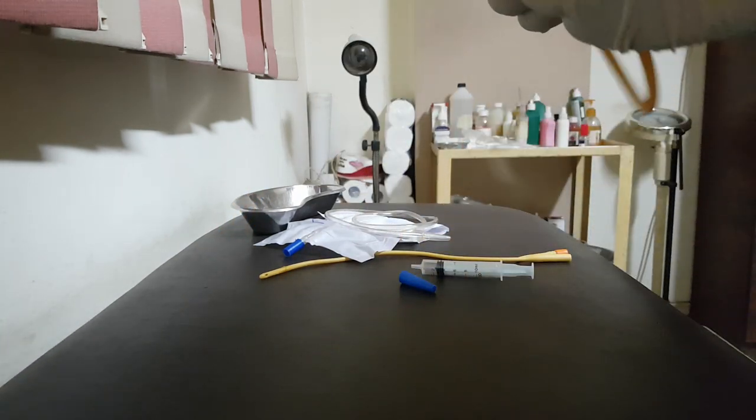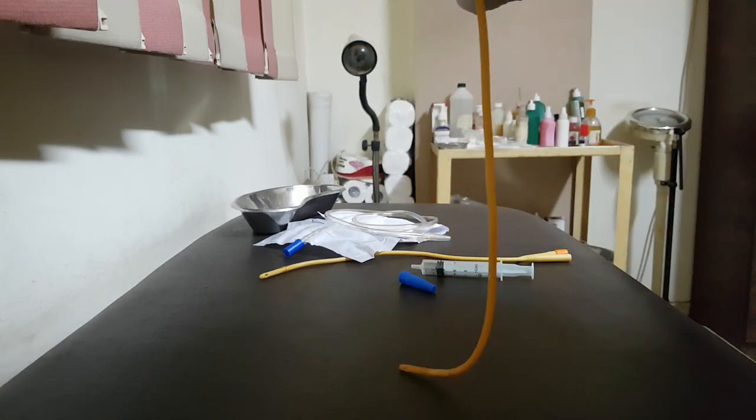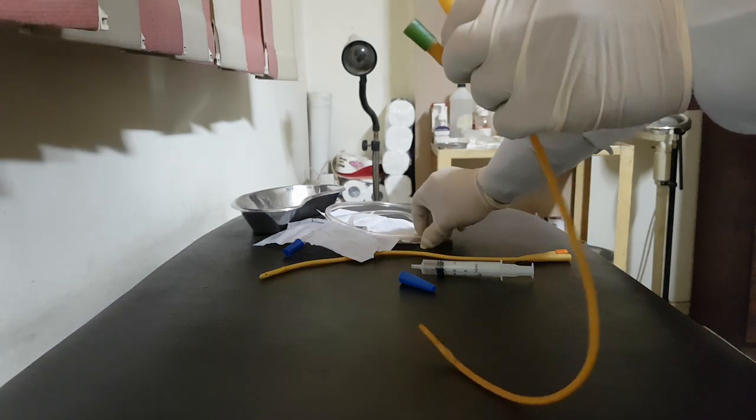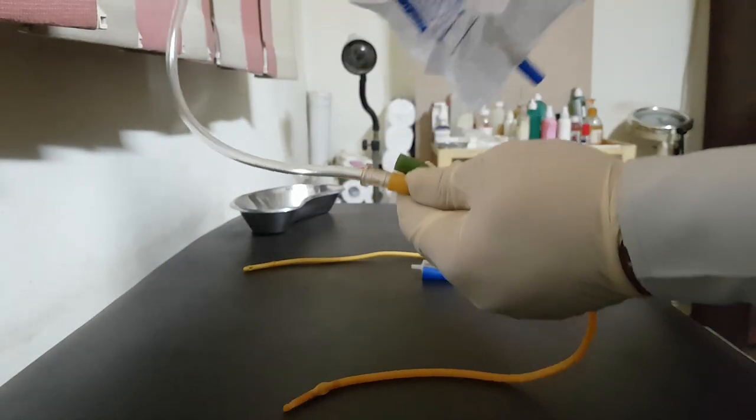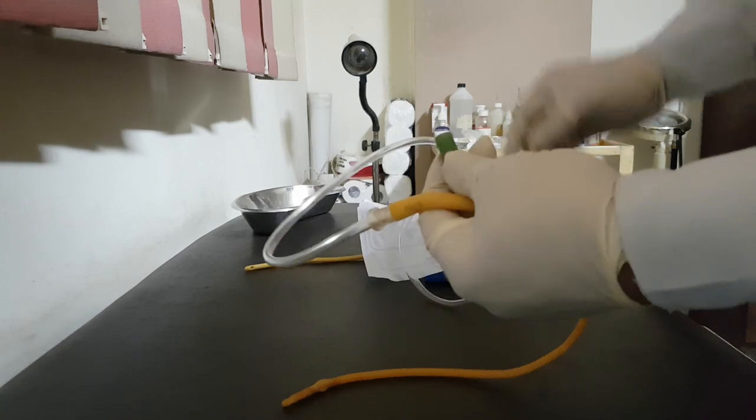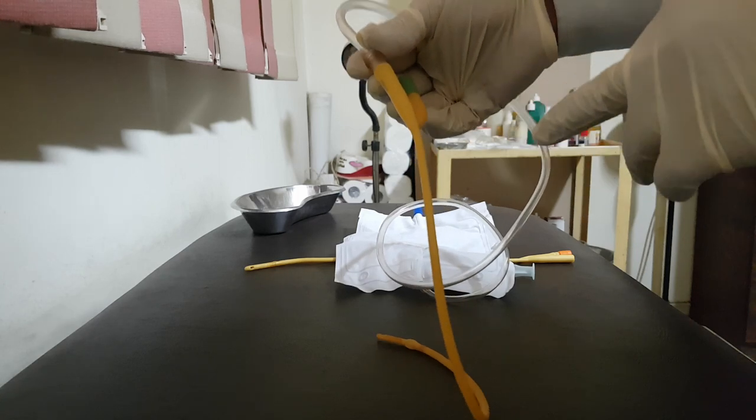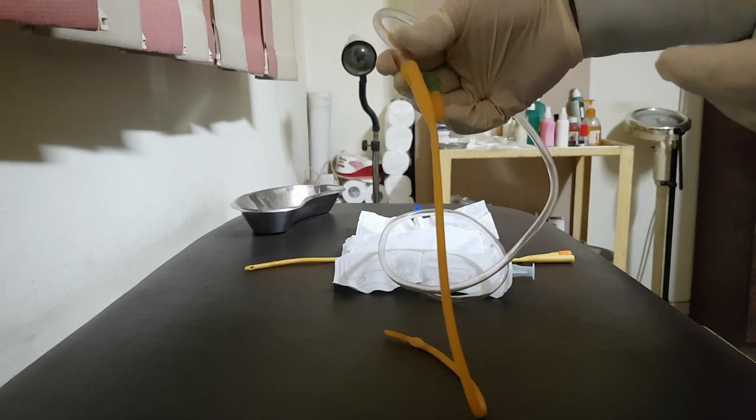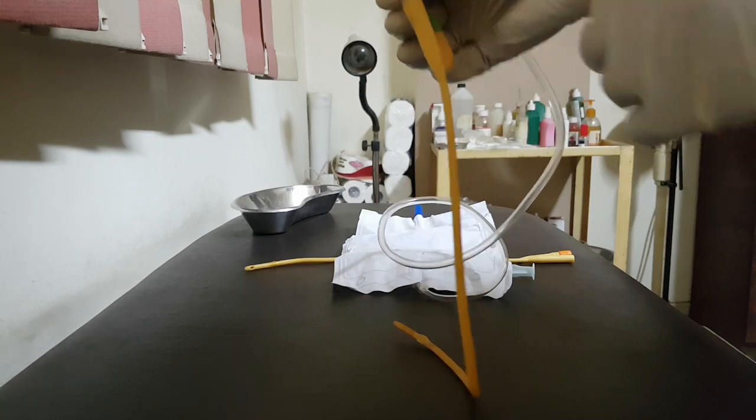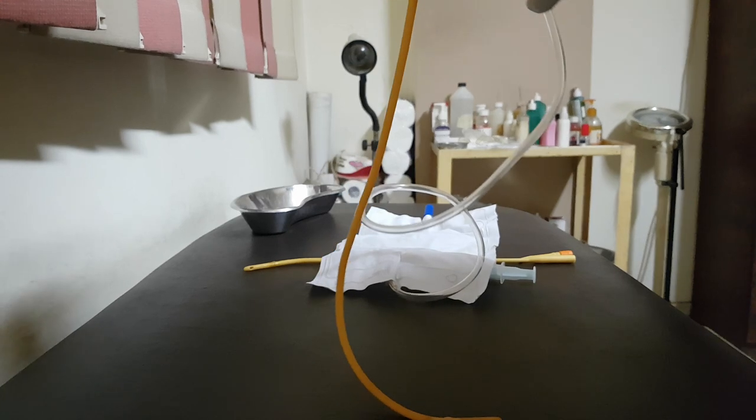There's another catheter with three channels but not available with me right now. The third, we know now that we have two channels: one for the passage of urine will be connected to the collecting bag of urine like this, and the other channel for the balloon. There is another catheter with three channels. The third one will be for flushing of the bladder after bladder surgery to remove the blood clots and the debris inside the bladder. But this example has only two channels: one for the balloon and one for the passage of urine.